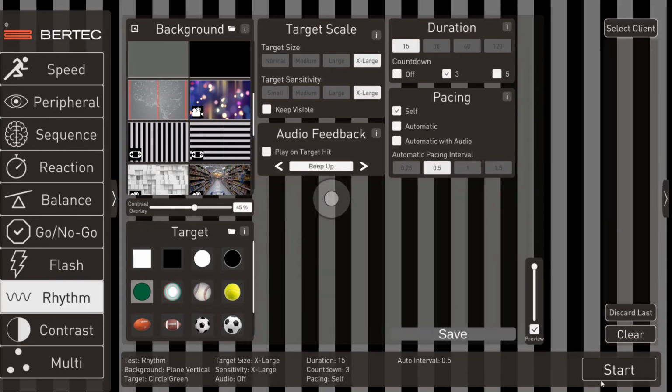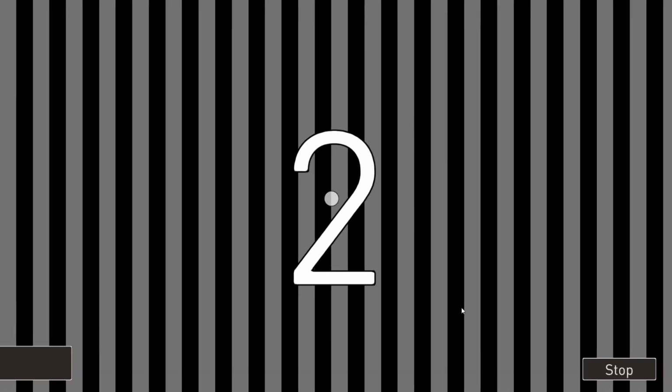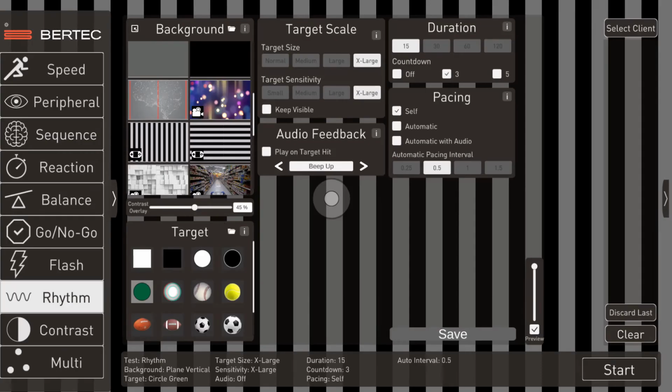This will cause the eyes to pursue away from the neglect side or loss, but it forces the eyes to make a saccade back to the loss side, and sometimes this is effective too. There's an argument to be made that it is good to do both directions, but the more accepted way is to have the slow phase move towards the side of neglect.